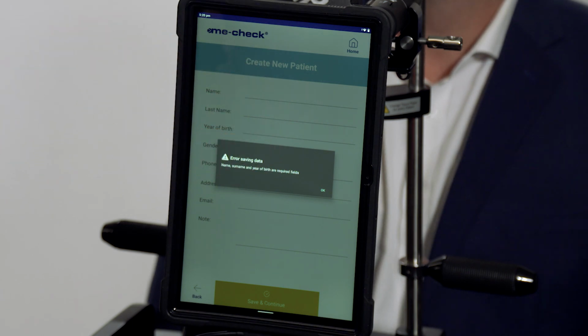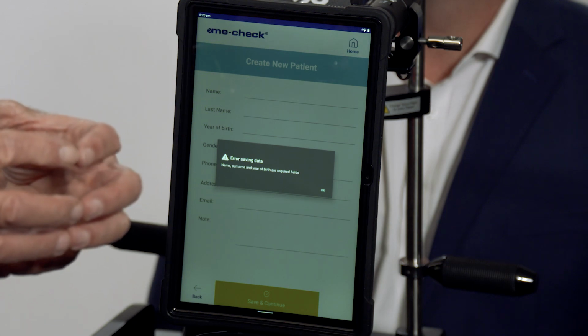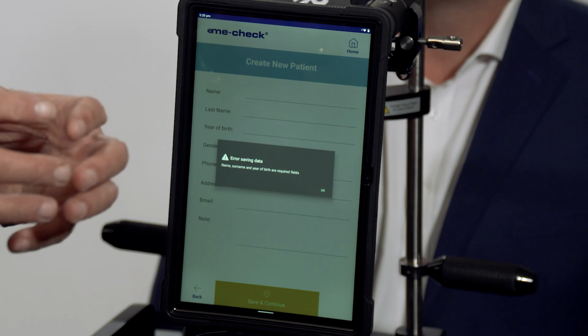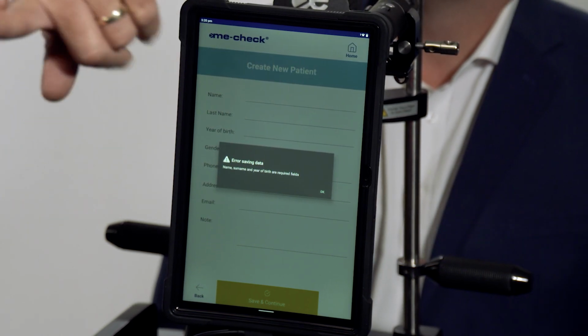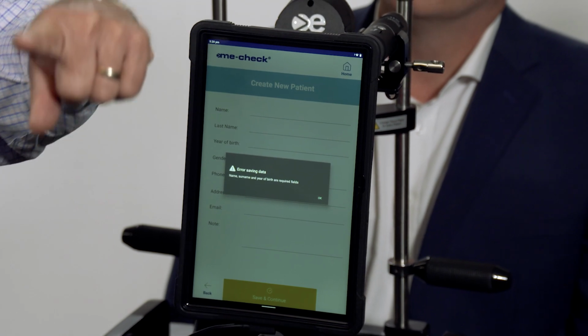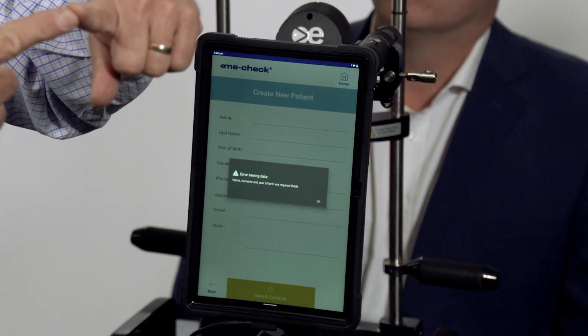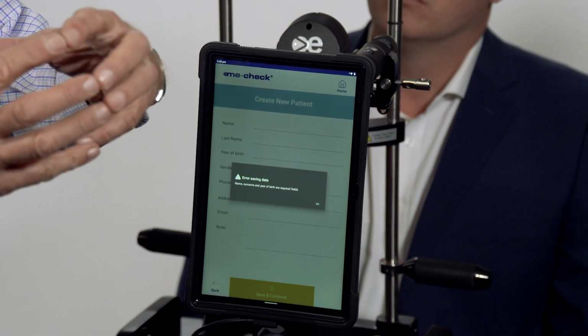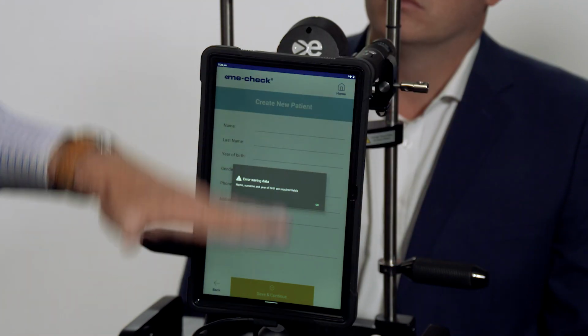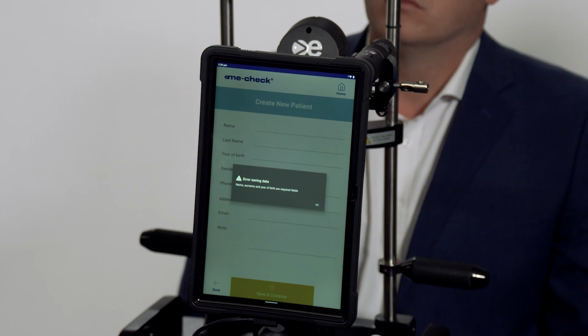at this point, to an EMR, but if the tablet was connected to the electronic medical record via Bluetooth, all the data, the demographic data that was just placed into the instrument, the meibography pictures that we took on the patient, and the OSDI scores could be dropped into the patient's medical record. It's also saved on the iPad where we can get back to it at any given time.